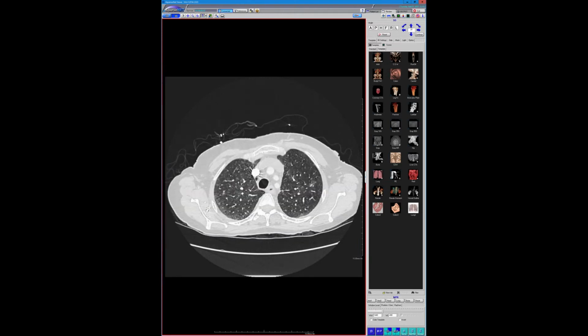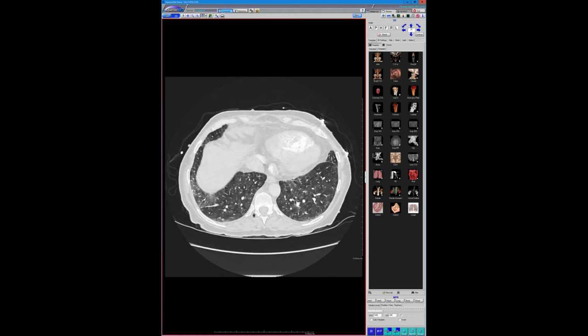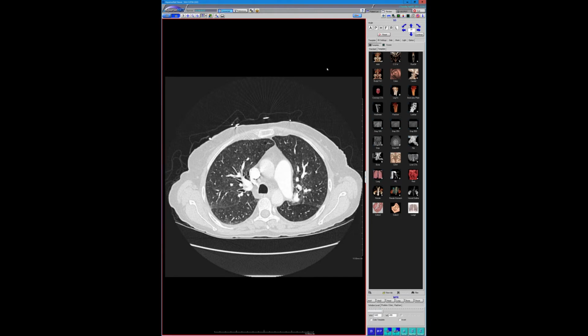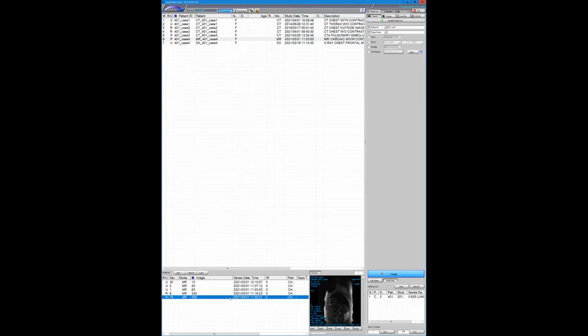So we see a lot of obviously pulmonary hypertension and CTEPH here. I just never seen a case in someone with NF. So it's just a random association I learned about the other day. This is, if I can get this thing to load appropriately. Let's see if this will load appropriately or not. Maybe it won't.